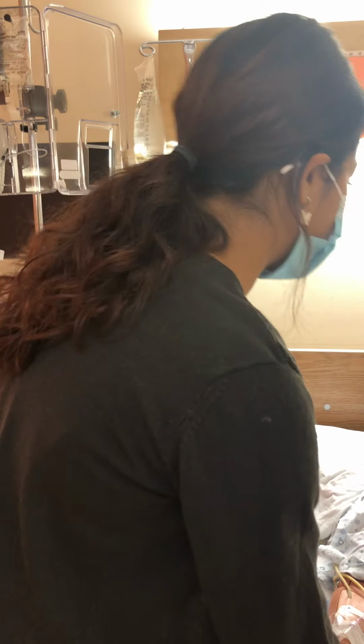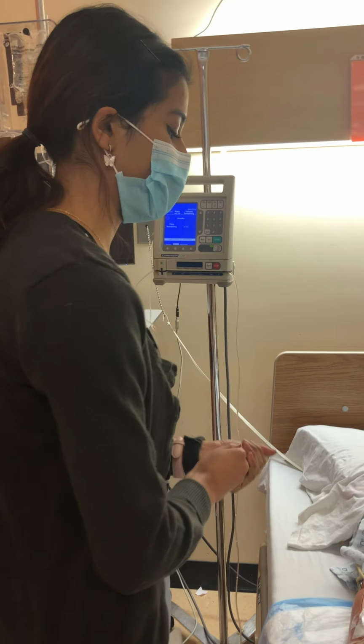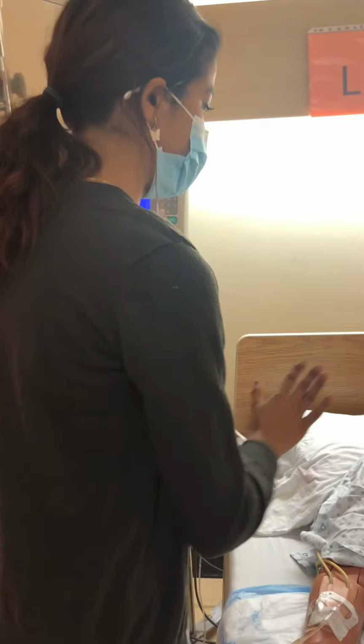So before I do that, I'm going to educate the patient. You're receiving this morphine as a PCA due to your surgical incision pain. You've already signed a consent for this, but I would like you to verbalize your consent to make sure that you're okay with me going through with this. Okay, patient said yes.